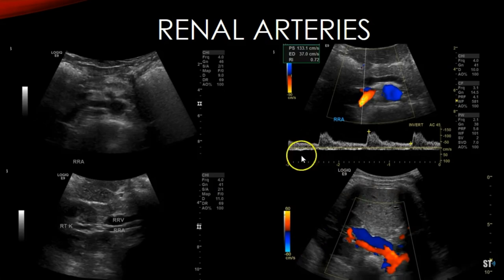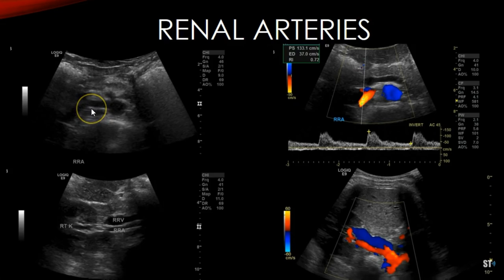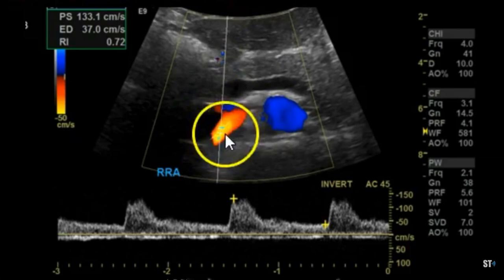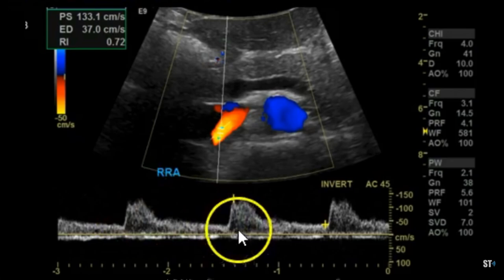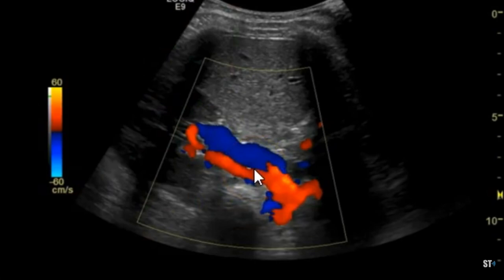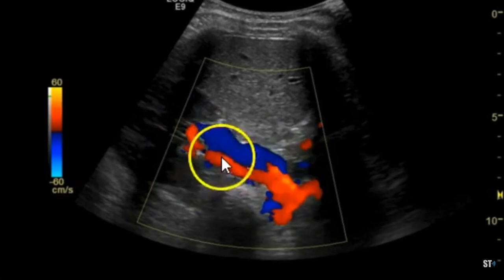If you're scanning your arteries through the anterior approach, you can use angles depending on positioning. If you put the Doppler at 90 degrees to the beam, you're not going to pick up any signal. So you want to angle your transducer or have the patient turn over. Here, the arteries are dipping away, so I'm at a 45-degree angle and getting a nice clean spectral waveform with a nice spectral window at 133 centimeters per second. Here's another view angled more to the left, getting the artery and the vein in longitudinal — and then this is at the hilum, showing the right renal vein and right renal artery.